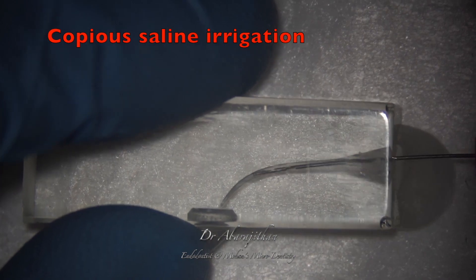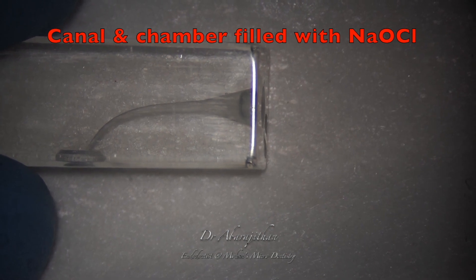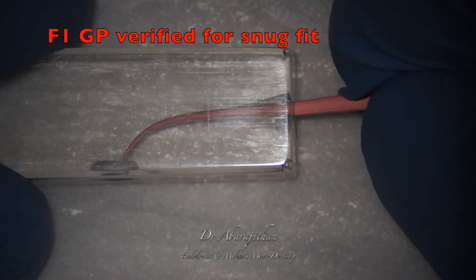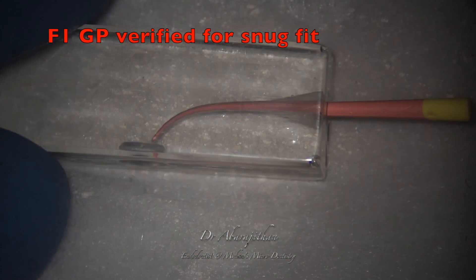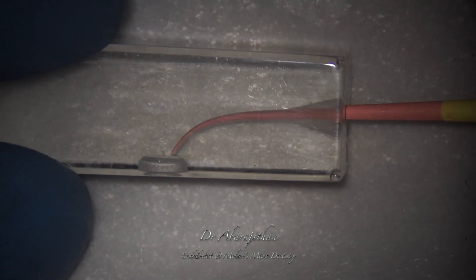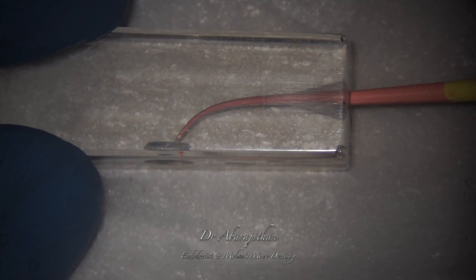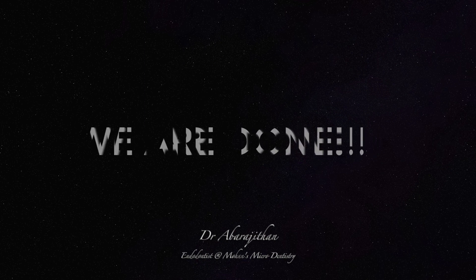Following this, we again repeat the copious irrigation with saline, then fill the pulp chamber and the canal passively with fresh sodium hypochlorite. Now an F1 gutta percha is used as a master cone and we check for snug fit at working length. If you achieve snug fit at working length, this will be your final master cone. Even if the F1 GP is protruding beyond the apex, it can be trimmed to fit at the apex rather than enlarging the canal to one size larger. We are done with the preparation in situation number 1.